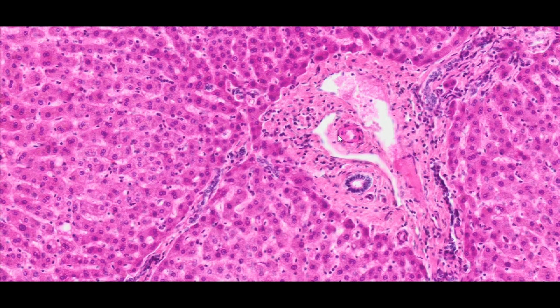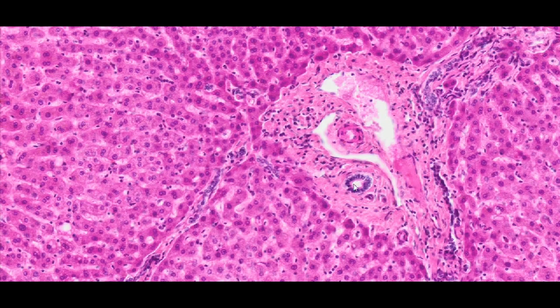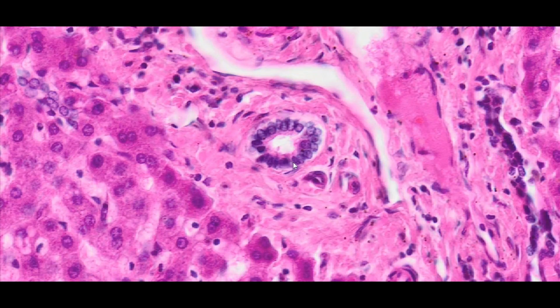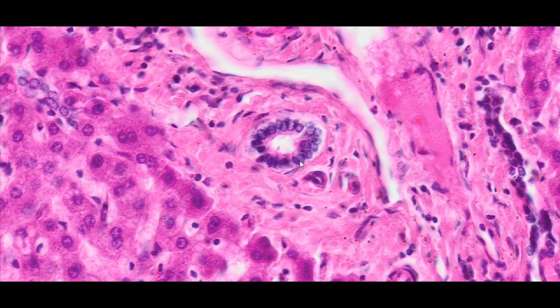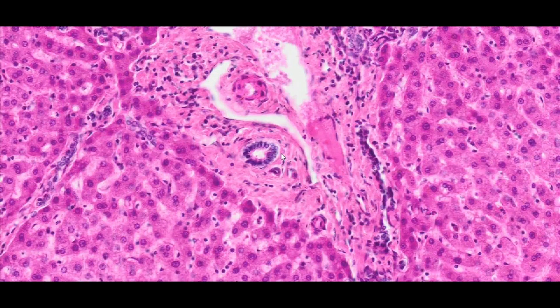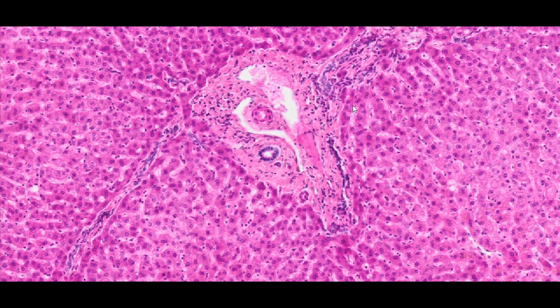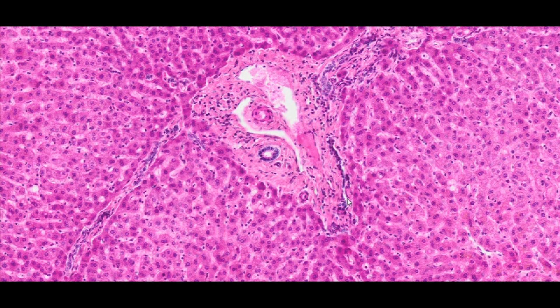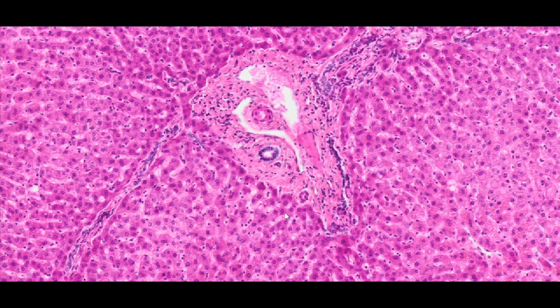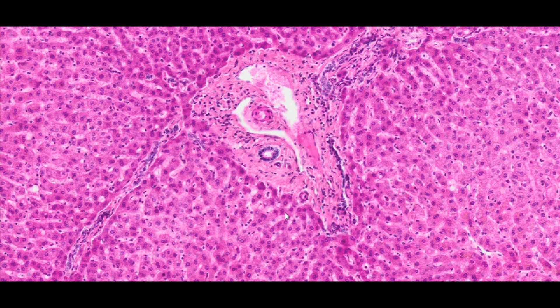The interlobular artery, the interlobular vein, and the interlobular bile duct, lined with a simple cuboidal epithelium, are found in these spaces. Together, they form the so-called hepatic triad. In some portobiliary spaces, tetrads are visible, with a lymphatic vessel as an additional element.